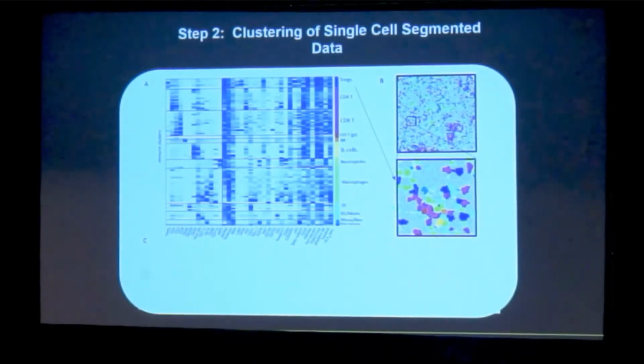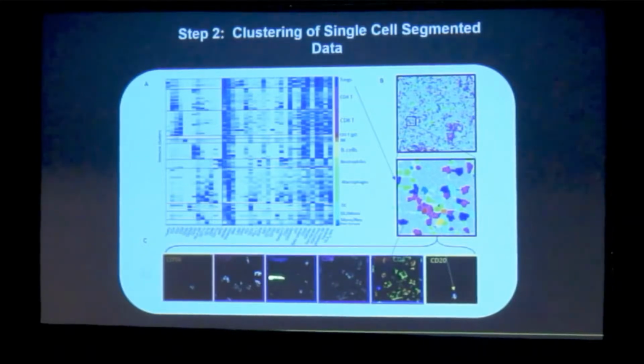And so just to give you an idea of the accuracy of it, we're pretty pleased. So for instance, this one little orange cell here is supposed to be an NK cell, and you can see it's the only one that's CD56 positive. This one little yellow cell here, or 2, I guess, is supposed to be a B cell. You can see this CD20 positive, and then the Tregs that are marked, I think in violet or something, you can see they're FOXP3 CD4 positive. So, by and large, the accuracy of this approach seems to be pretty good.